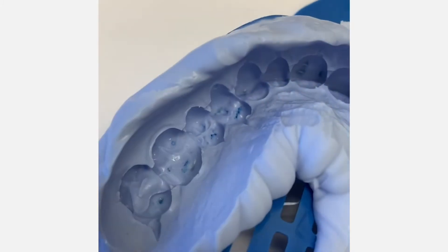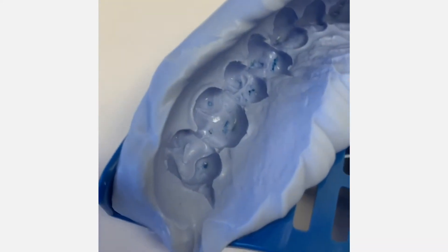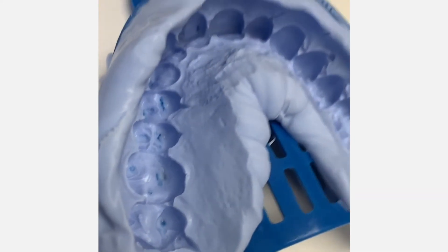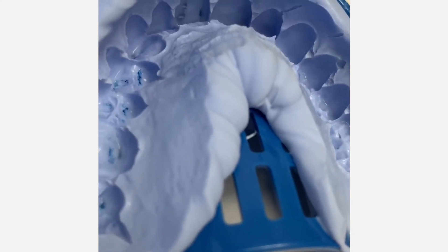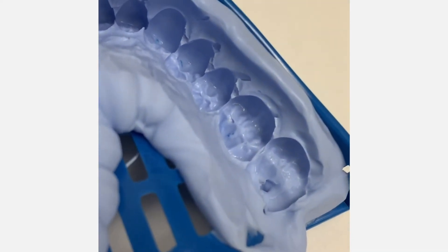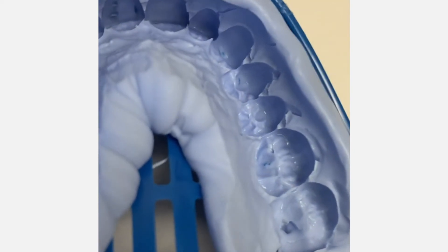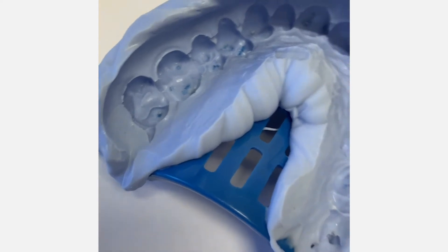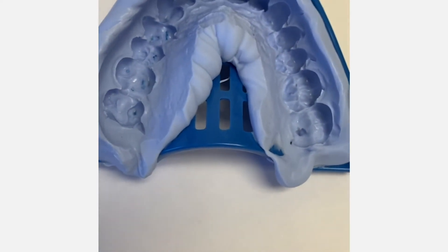As we start to look at my impression, we can notice that there are some definite drags, maybe even a little bit of a tear on the impression. So what we're going to do now is place and reline this impression so we can capture all the detail that we need.